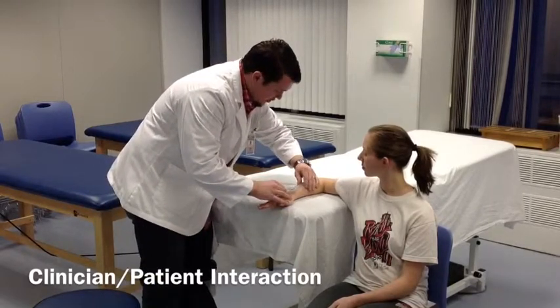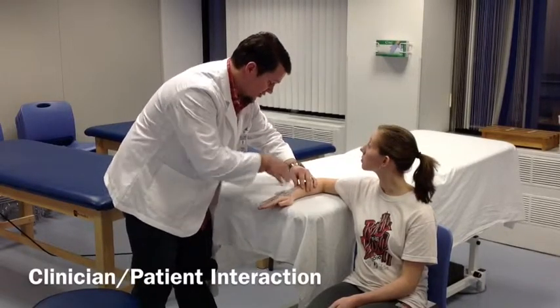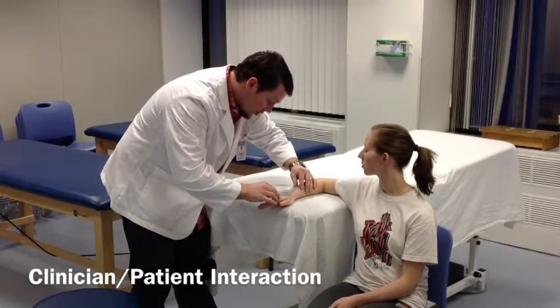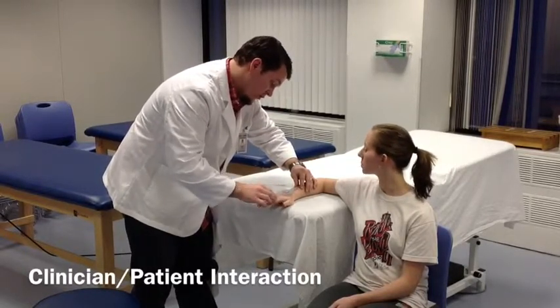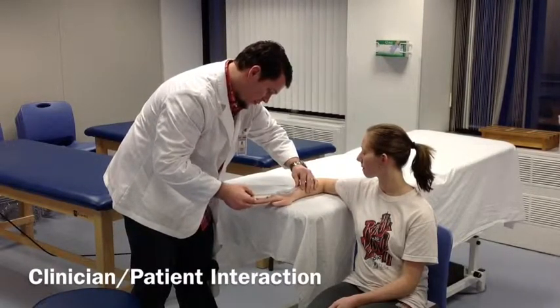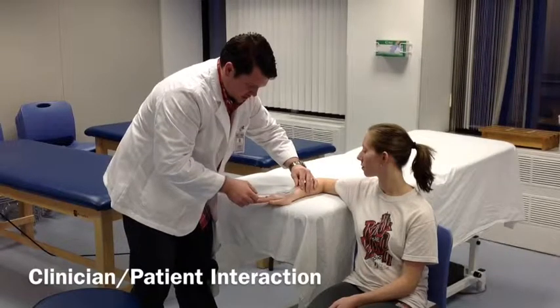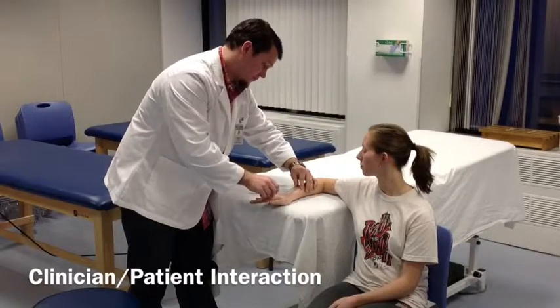I'm going to hold the stationary arm so it's bisecting, running down the midline of your forearm. The center of this is lined up in your hand, and the moving arm is right down the center of your hand here. If you can go ahead and go through that movement again for me. Okay, that's about 38 degrees of movement there.